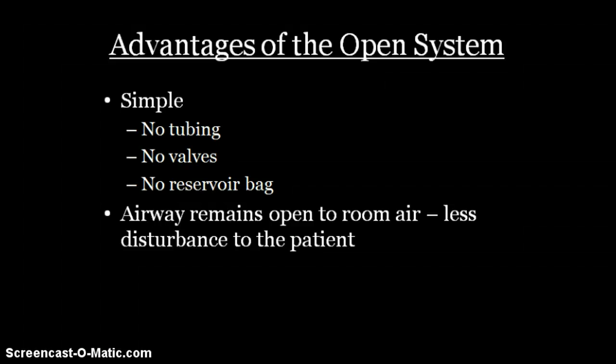The advantage of the open system is its simplicity. With no tubing, valves, or bags, there is little that can go wrong with the system. They cause less disturbance to the patient than other systems, which is particularly helpful for anesthetizing children.